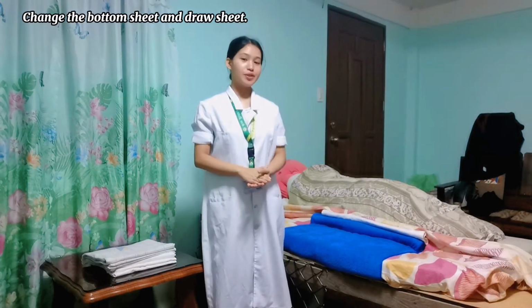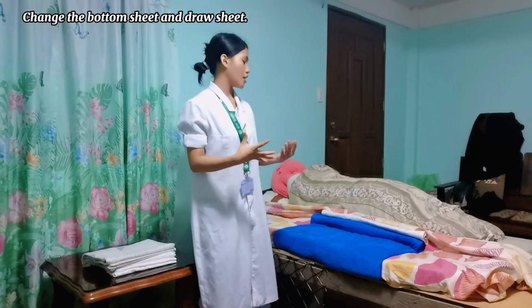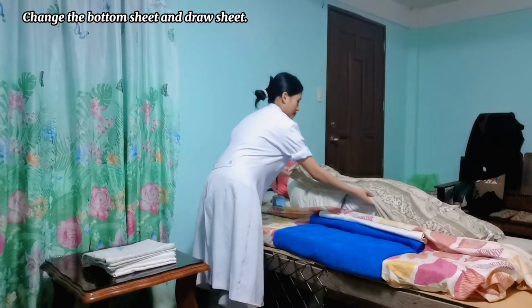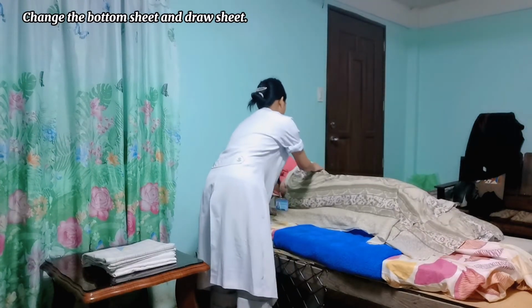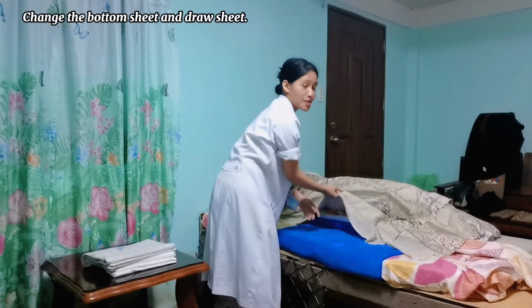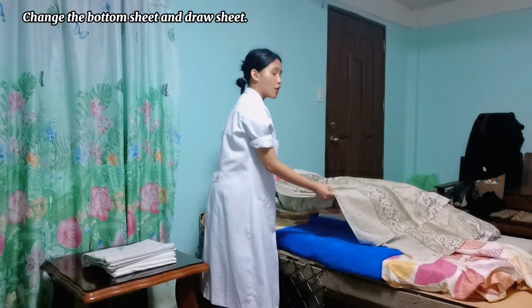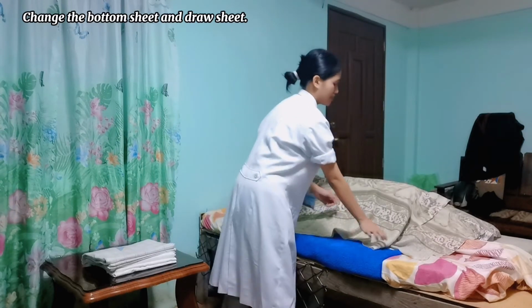The next thing we will be doing is to instruct or position the client to the center of the bed. This will prepare the client to move to the other side or the clean side of the bed.